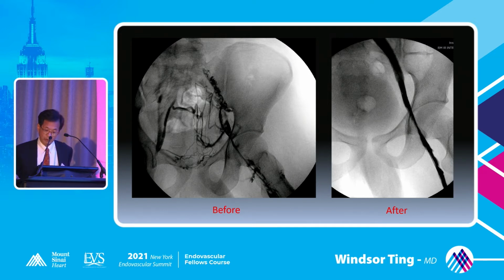And after intervention is the venogram on the right side. You see restoration of flow throughout her iliac vein. Quite a satisfactory outcome. There are numerous options that you can use to go from the venogram on the left to the venogram on the right.